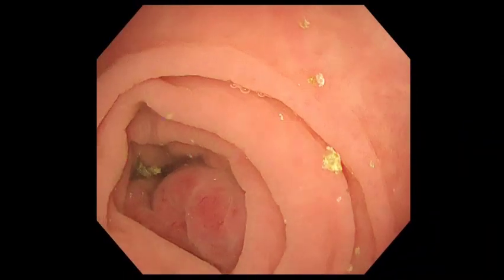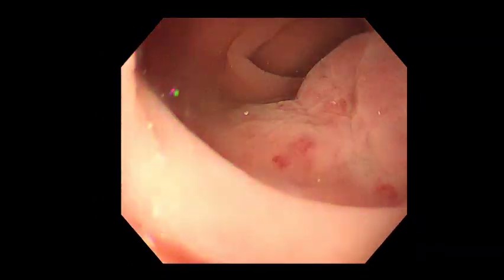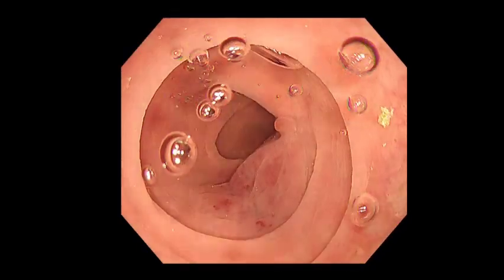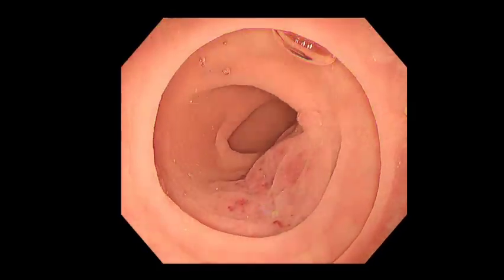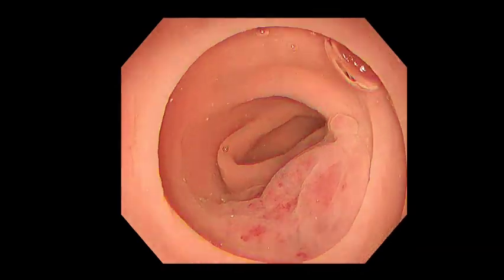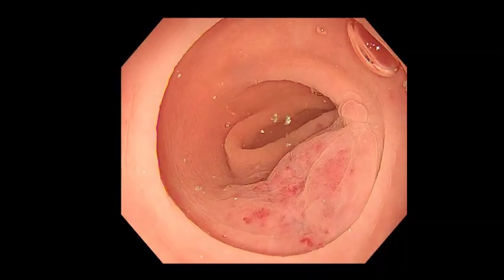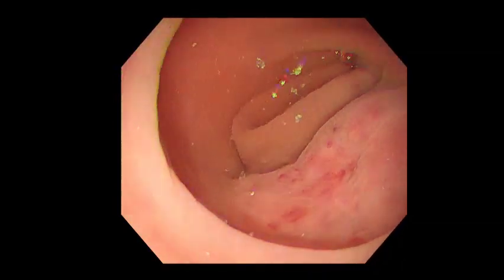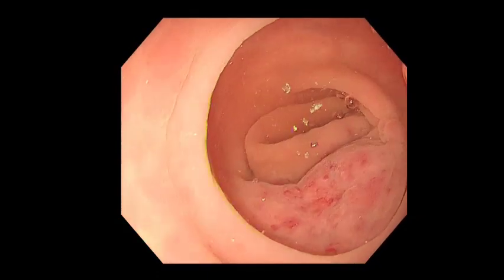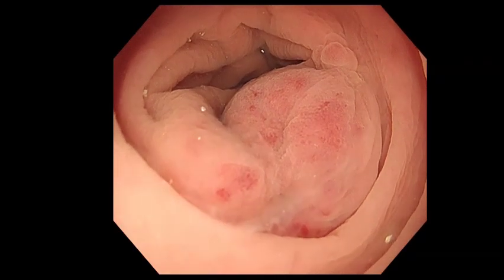The usefulness of the gel immersion technique using a transparent gel with appropriate viscosity, Viscoclear, for securing the visual field to identify the bleeding site and for EUS has recently been reported. Therefore, we injected Viscoclear to maintain a clear visual field during endoscopic examination, identify the region, and perform EUS. After gel injection, the pulsating region was observed clearly in the space occupied by the gel.